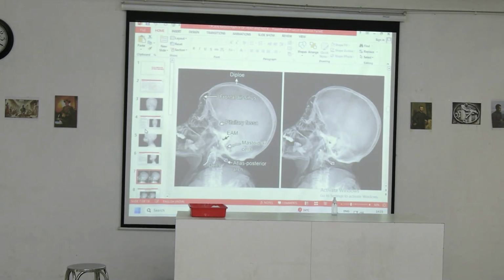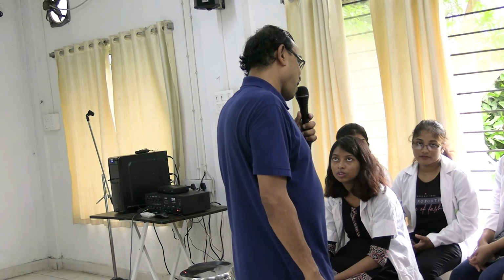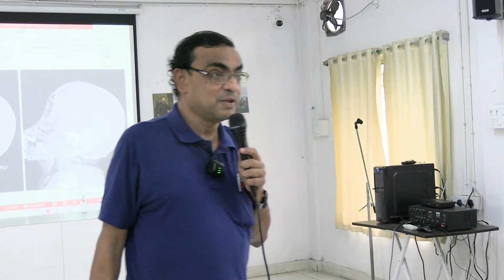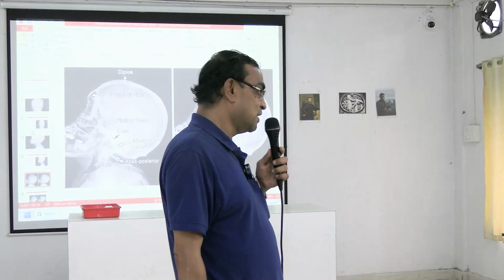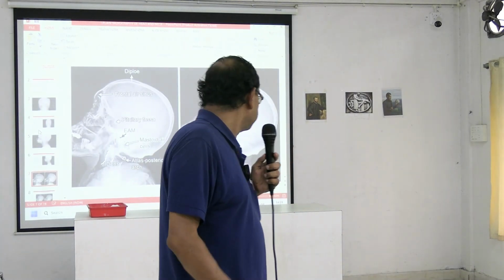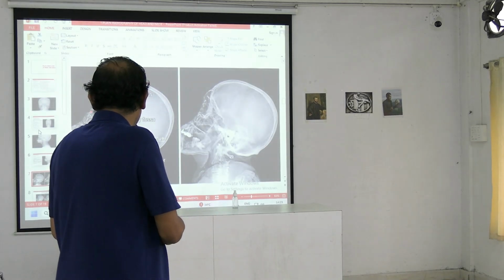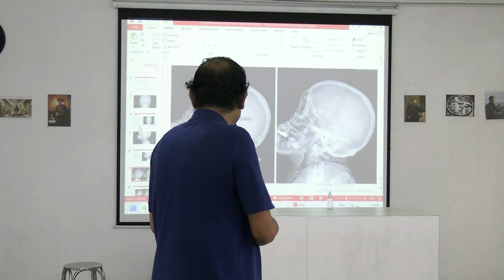There are so many dural venous sinuses, but mention only one important one. Cavernous sinus, very good. Cavernous sinus is very important, and cavernous venous sinus thrombosis is a bad clinical condition. So we can get outer and inner table.